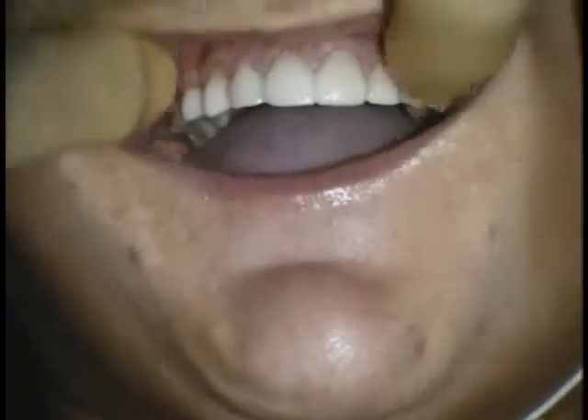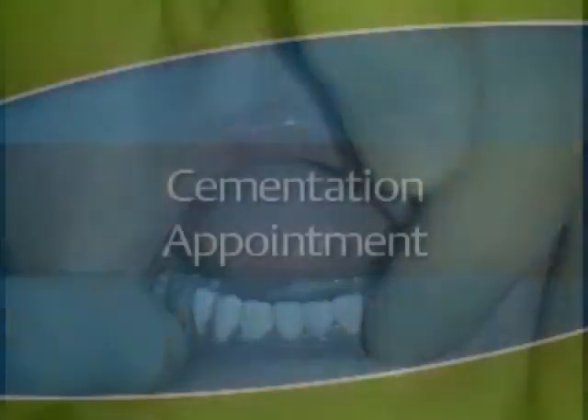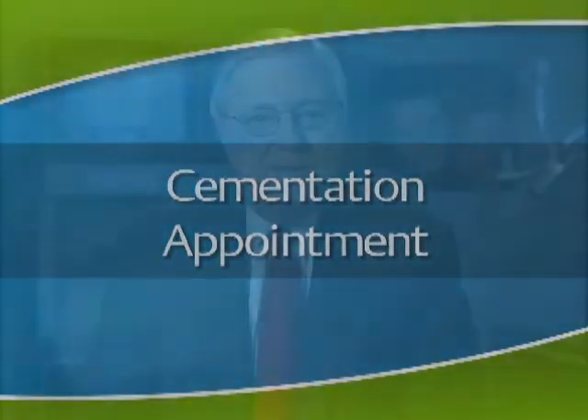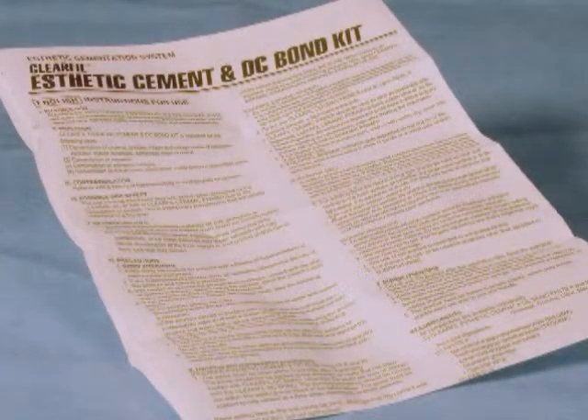This view of the completed preparation shows the complexity of the situation. The patient was placed in provisional restorations and reappointed. The Achilles heel of every dental product is the failure to understand and carefully follow the manufacturer's instructions. I have developed a consistent technique that we follow for every veneer cementation. This is especially important in aesthetic cementation procedures where teamwork is critical. The team should actually practice these steps to ensure that they thoroughly understand the manufacturer's instructions.